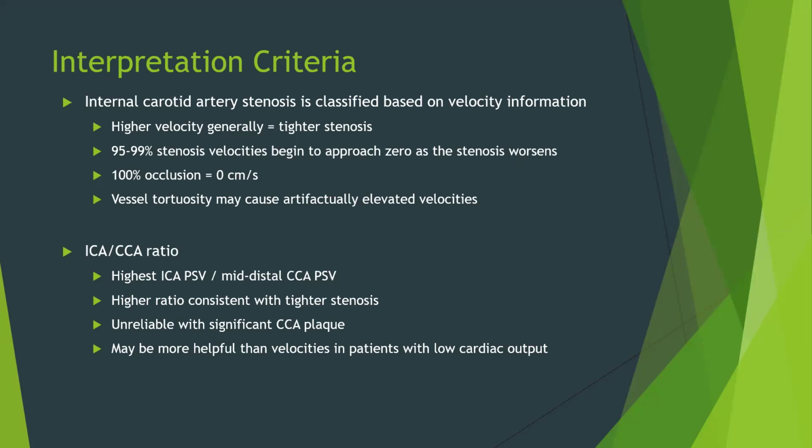So when we're grading a stenosis, it's really important that we're treating patients, not pictures. So make sure that we're seeing plaque with our elevated velocity. We're not just going to be taking pictures of high velocities. We're going to make sure that we visualize the plaque with the higher velocities. And so that can help you differentiate between tortuosity and actual stenoses.